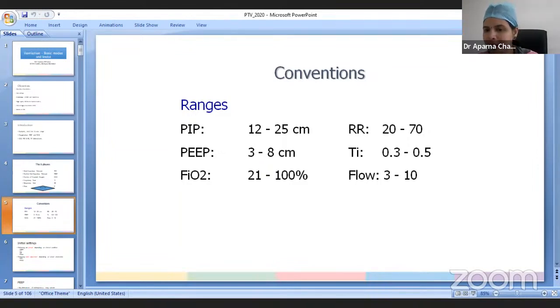And when we give the optimal I time, we see that after the baby has complete chest rise, or when the chest is maximally inflated, it remains there for a plateau phase before it drops down. Whereas if we have excessive I time, then this may result in a prolonged inspiratory hold and ineffective ventilation or asynchrony also. So we need to figure out where exactly the optimal I time is, where there will be a short period of plateau after the baby has achieved complete chest rise. Likewise, if the expiratory time is compromised, we all know that there can be gas trapping.